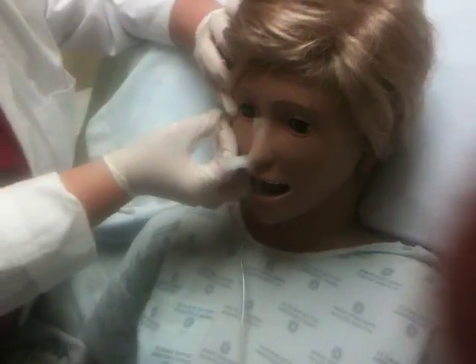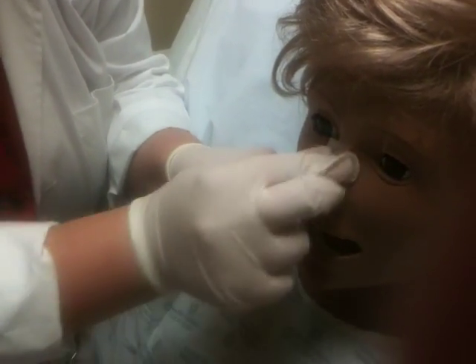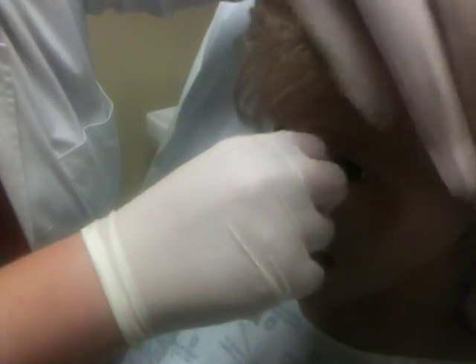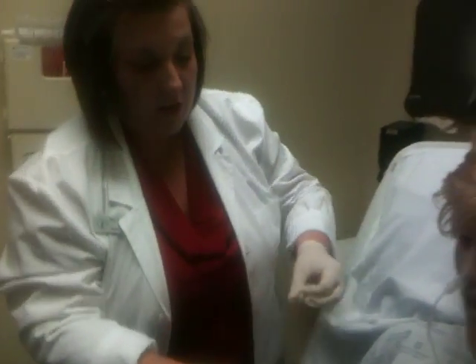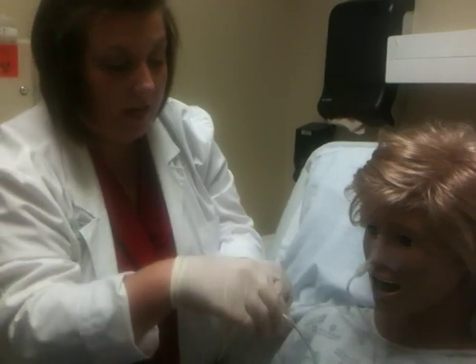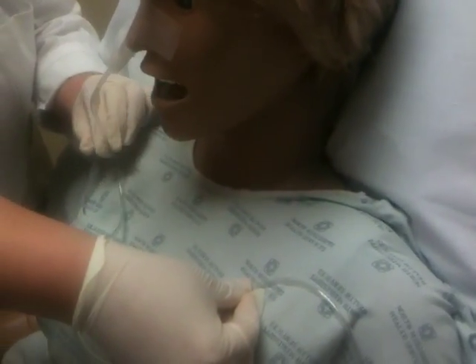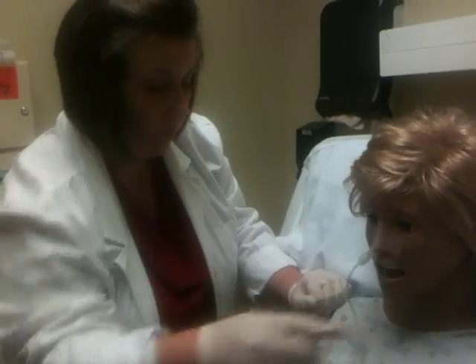I'm going to release it from the cheek. Go ahead and put another piece of tape across the bridge of her nose to help reinforce it. Then you could take either a commercial device or a rubber band and a safety pin or even some tape and secure it to her gown so that it would decrease the risk of pulling it out. Okay.